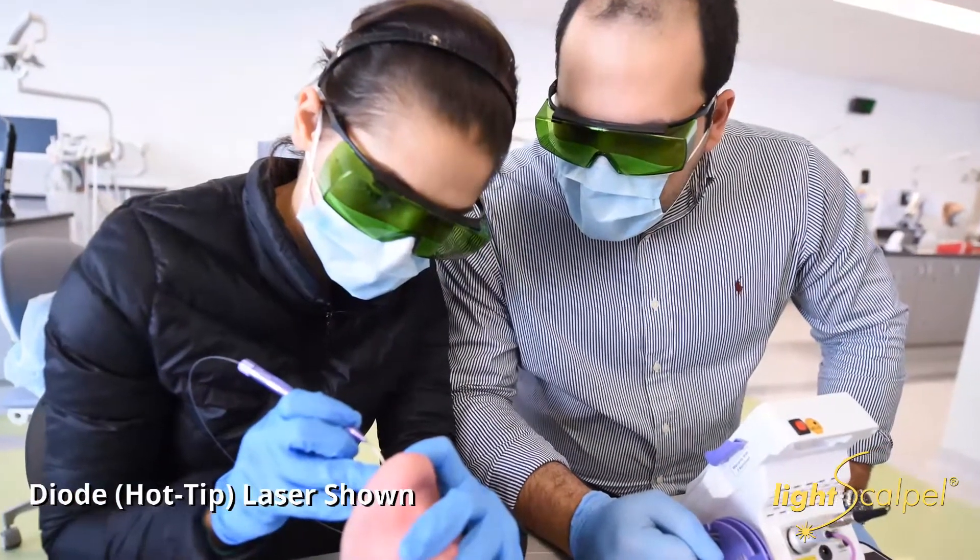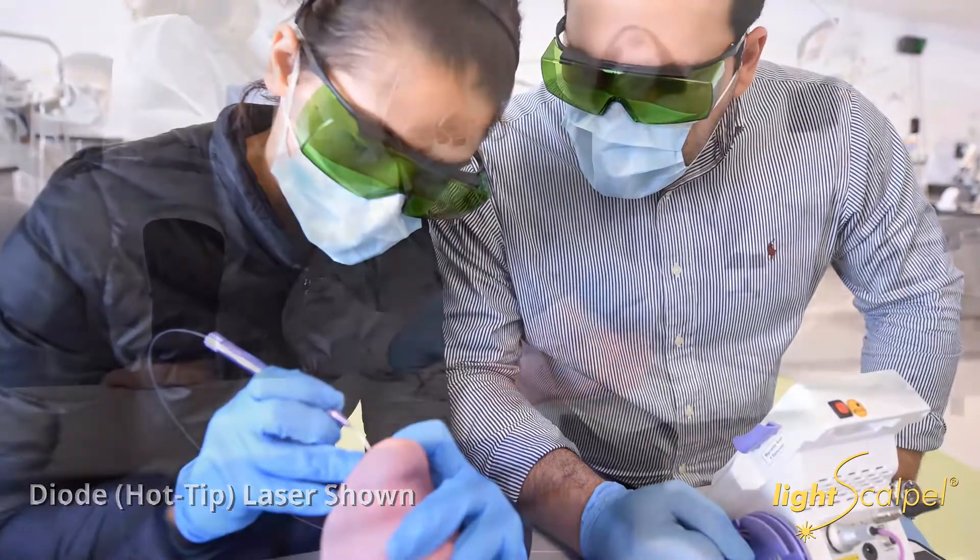We started out with a diode laser. So for about 18 months, when we first started doing procedures — frenectomy procedures specifically — we used a diode laser, and you can tell a huge upgrade with the LightScalpel.